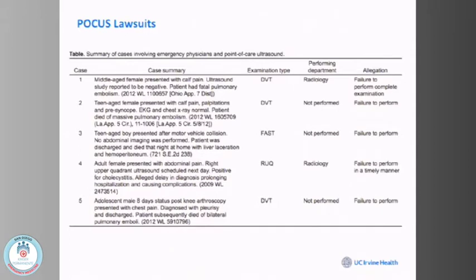The patient died from a PE, a massive PE. The department failed to order a DVT ultrasound. And so, how many of you have diagnosed DVT in a teenager? I had a recent case of it, a very interesting case. This is one of those things that's kind of rare, but ultrasound lowers your threshold to pick it up.